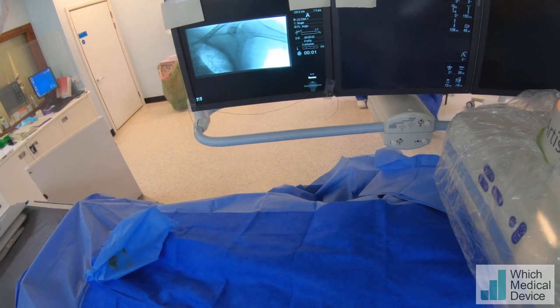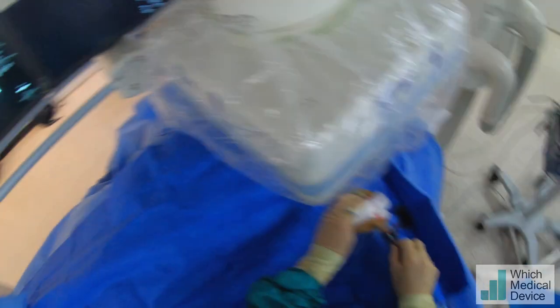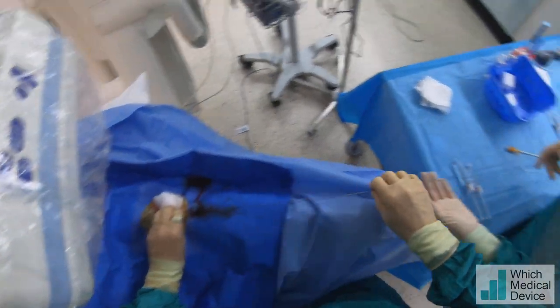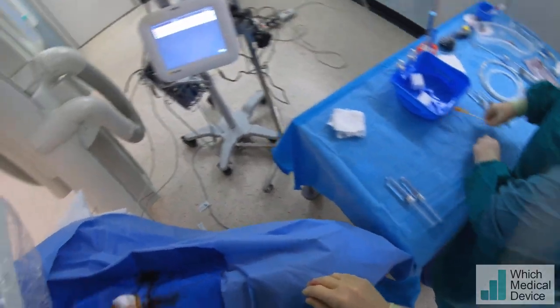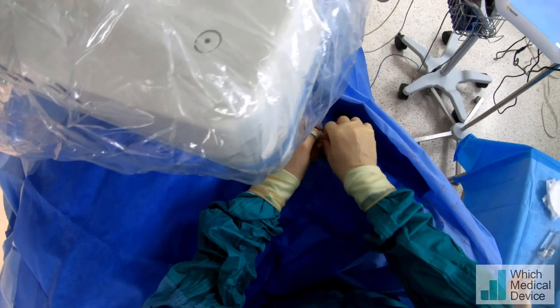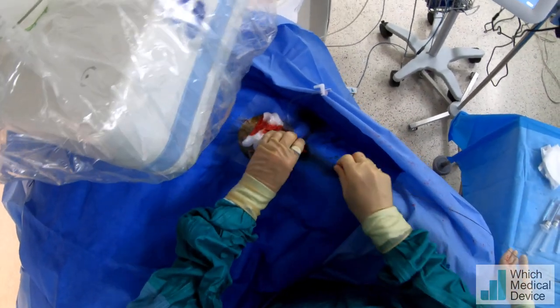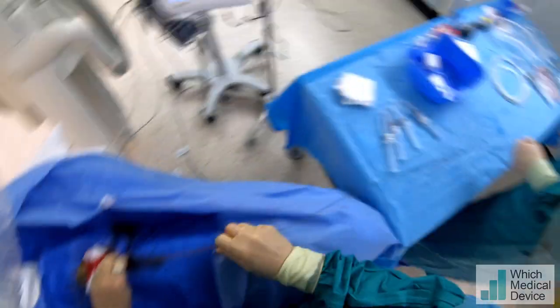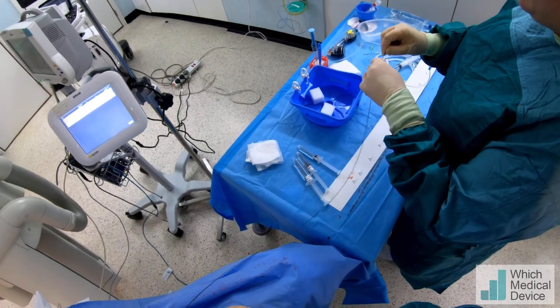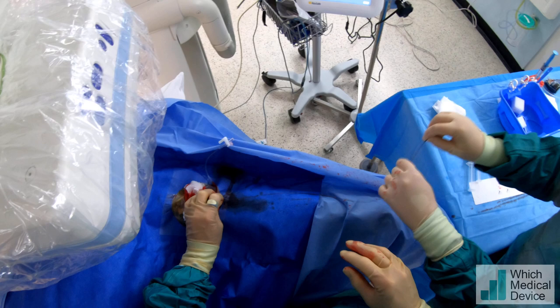We've just got our J-wire all the way around to the cephalic arch — you can see there's a little bit of resistance there. At this point we're just going to change and put our seven French sheath in. It's a standard vascular sheath and just rotating that sheath in — it's gone in relatively easily. Now, that's just a short angle catheter; we could use any angle catheter for this — it's just to direct us through the cephalic arch.